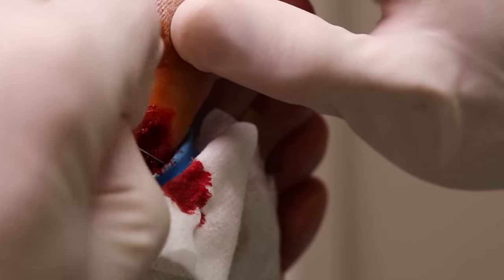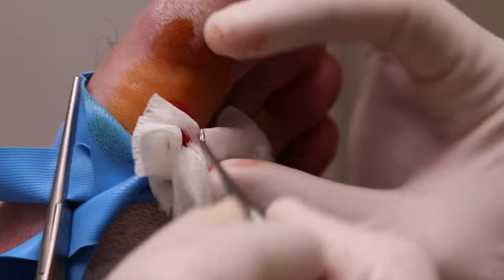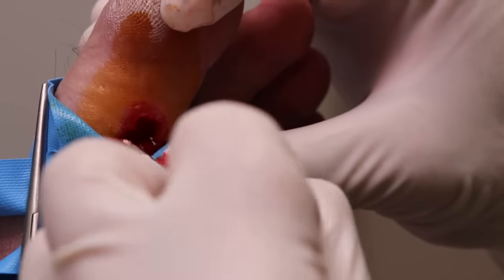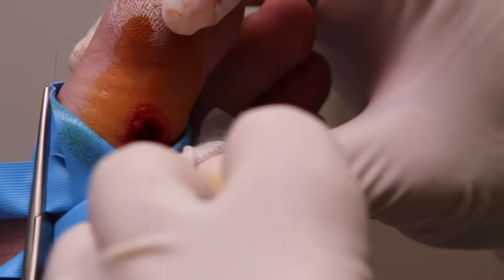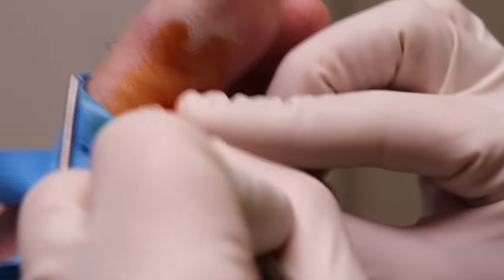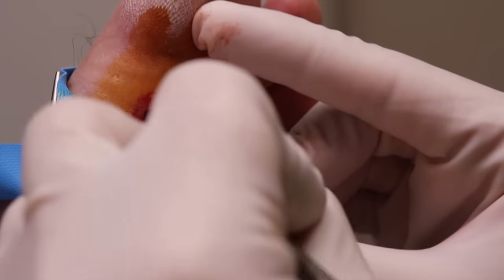Let's get some of this dead skin off. If I can't see really well, we might put on the ankle tourniquet. But for now it's doing okay. Just trying to get all this warty tissue off. Realistically, the cryo or even the home kits would have been no use — it doesn't matter what we did with this one.